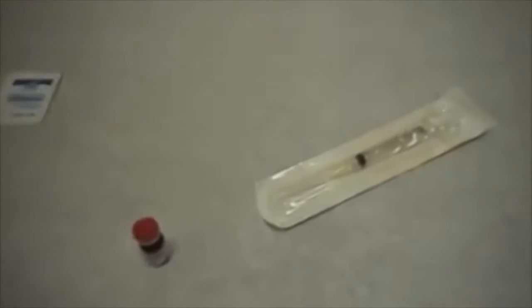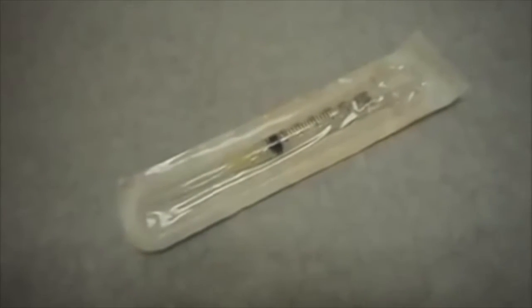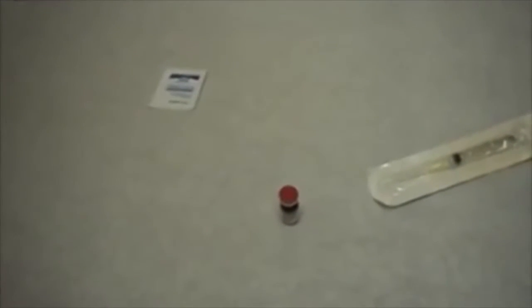You will need a syringe, which will be prescribed by your physician, depending on your size and where you're going to inject. You will need the vial of B12, which can come in a 1-dose vial or a larger 10-dose vial. And you will also need an alcohol swab, or you can use a cotton ball with alcohol. Either is okay. The next step is to wash your hands prior to any preparation or injection of the medication.